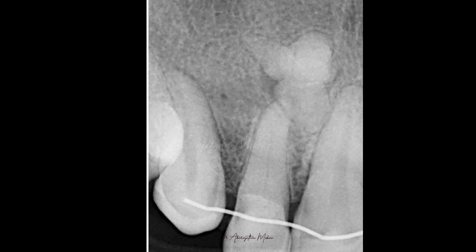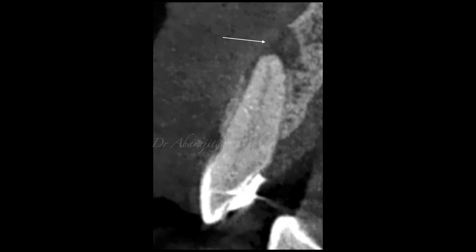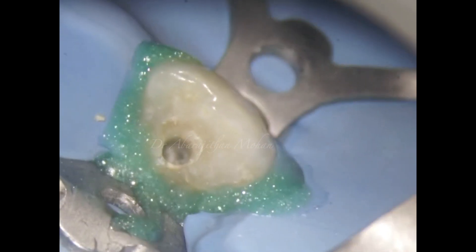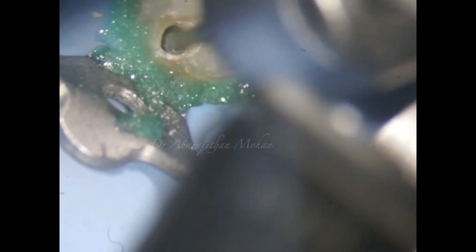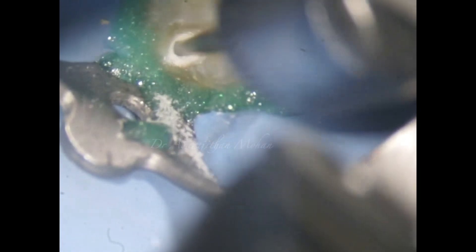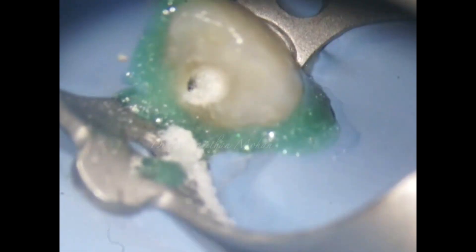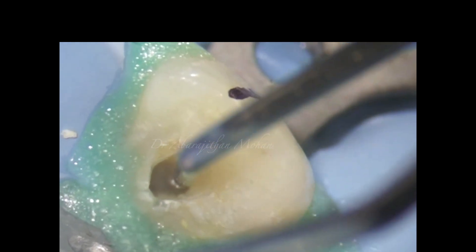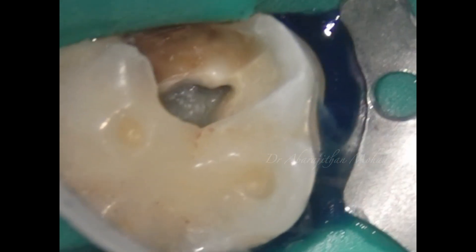In another case, we have a calcific metamorphosis with a tooth having a lesion. When there's a lesion, we need to intervene endodontically. My CBCT confirms that I need to drill through some dentin in the coronal third of the root canal, and this is not possible with high speed airotor burs. So here also I'm using these long neck burs — you can see I'm using a much smaller one compared to the one used for de-roofing. We are now able to gain patency and complete this case.